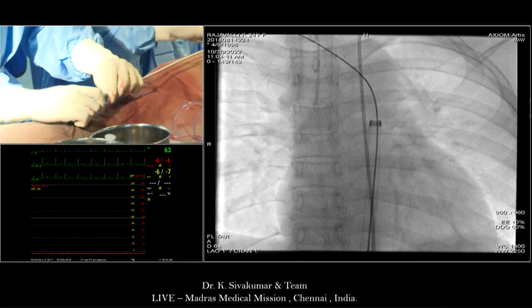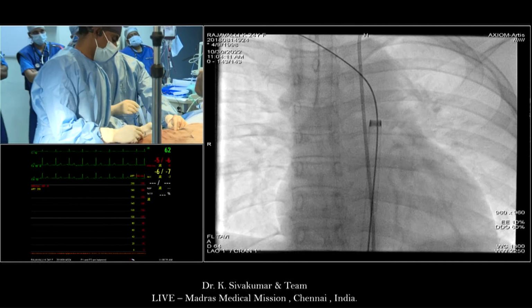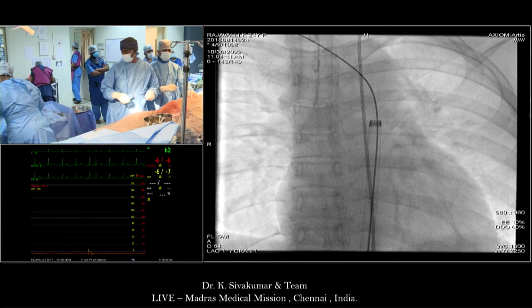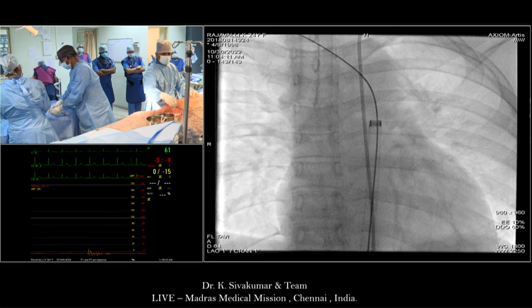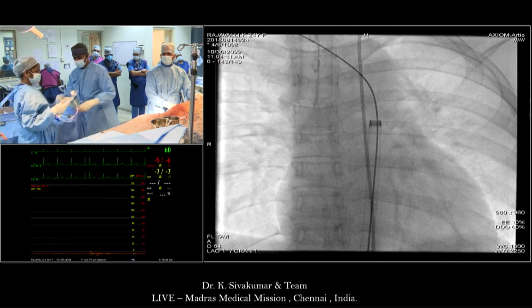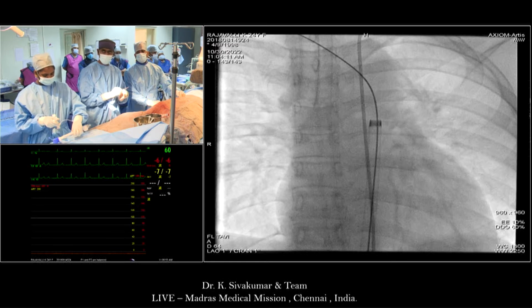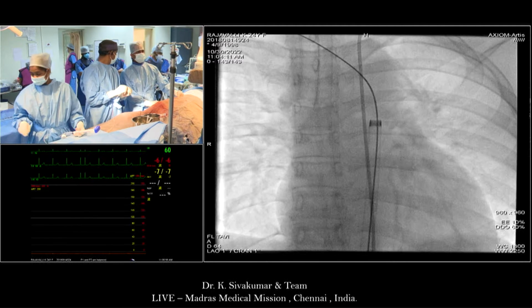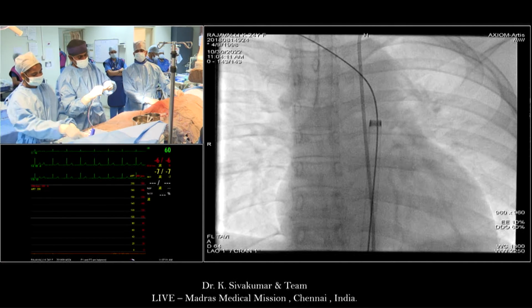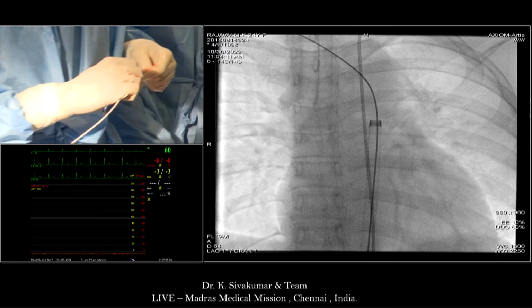In this lab, I have Vishnu and Ashok, my two colleagues, one at the femoral end and one at the radial end. Ashok is ready with the radial access angiogram, and Vishnu was putting in all the catheters and wires. In radiography, I have Mohammed and Subin, and the anesthetist is Dr. Arun, Dr. Giridhar. Dr. Uday is the head of the ICU team. He is also supervising.